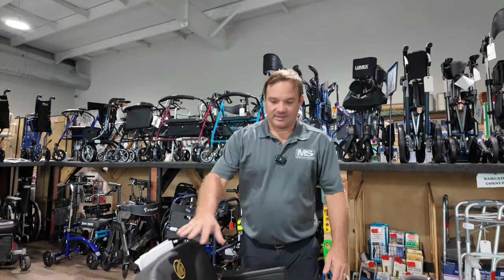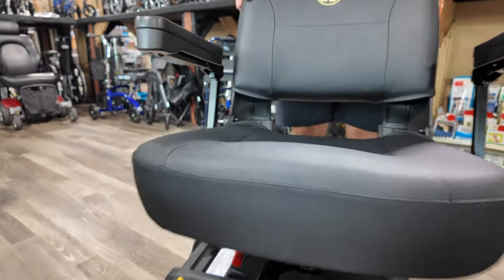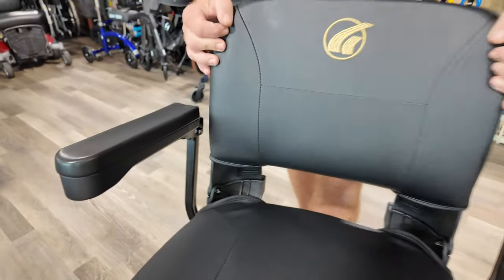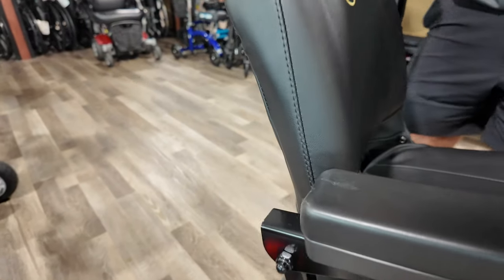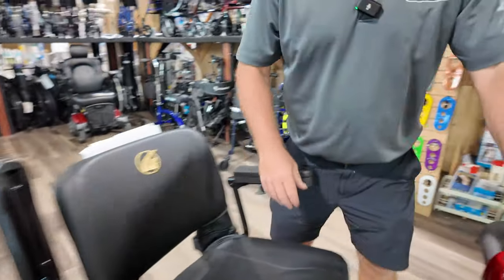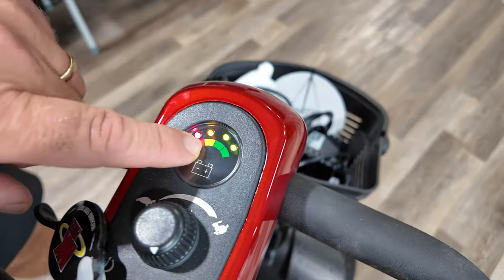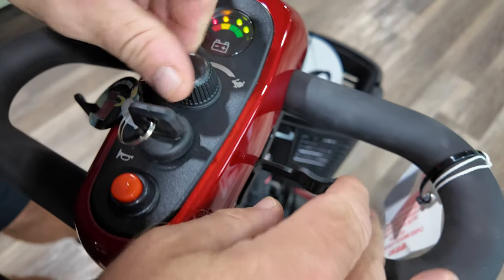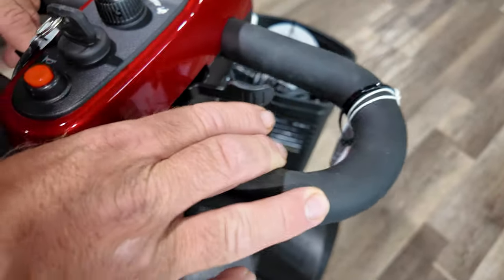The seat is a nice swivel seat, and it can also be bought with a 20-inch wide seat. The LX is another version of this model. The arms can flip back. Up here is your tiller dash — very simple. The key turns it on, there's your battery indicator, and this is your speed control. This is your horn, this is forward, and this is backwards.